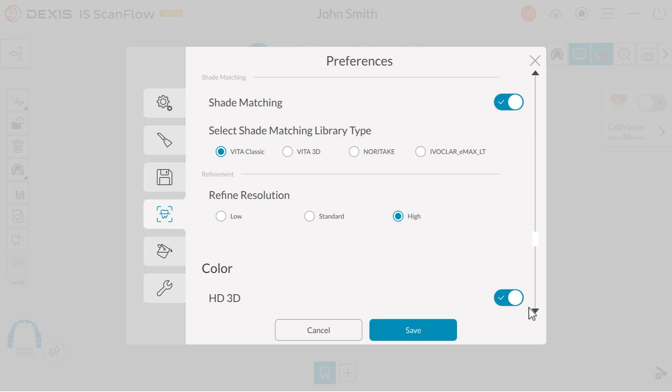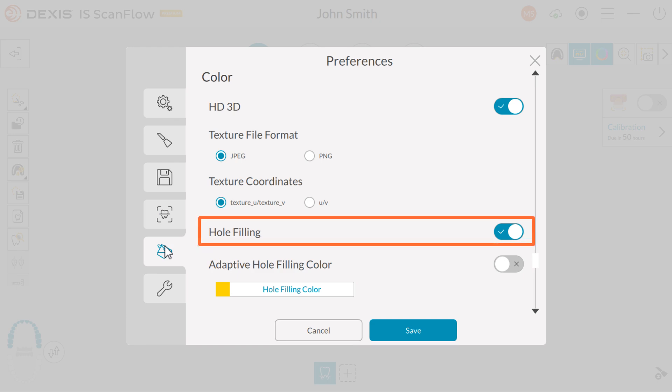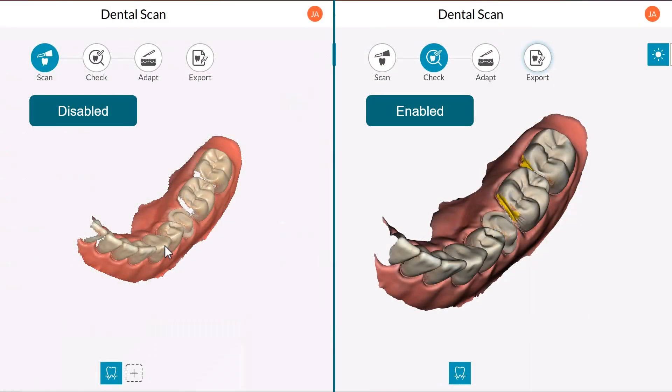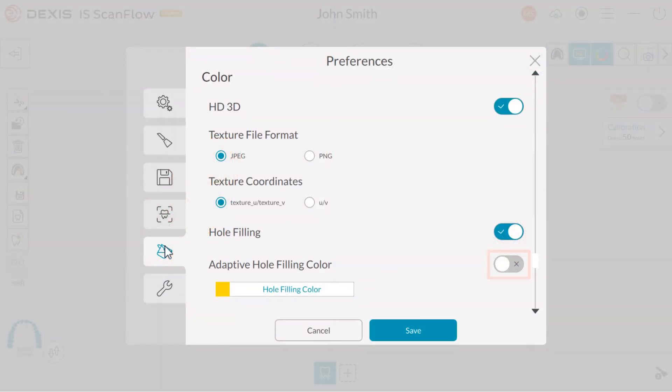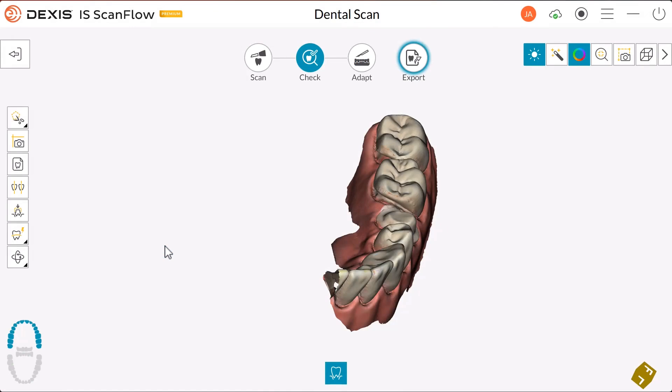Next, click the Color tab. Under Color, you have the following options. Hole filling, which is routinely enabled: the software manufactures data to fill in holes in the scan after refinement. The color displayed is based on the selection of hole filling color. To change the hole filling color, click hole filling color and select the desired color. Adaptive hole filling color: if enabled, the software uses a neighboring color to fill in a hole. Note: this option is only available when Enable HD3D and Enable Hole Filling are both selected.